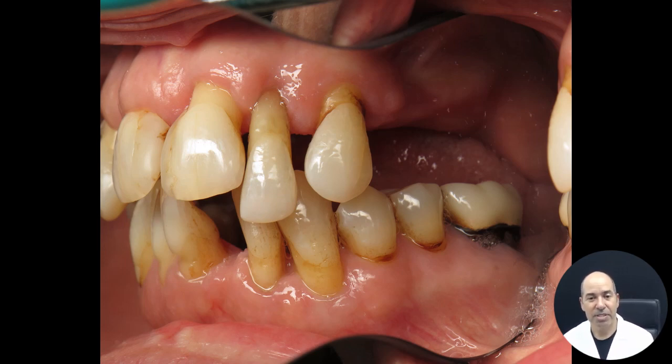And in my office, this is all done digitally. There's one appointment before for some scanning, and we do digital design. I don't have time to go into all of that, but I know you've seen some other blogs on that, where we want to simulate the smile, simulate the bite, take a picture of what she used to look like, how I want her to look, and design that in 3D. Save that file so the day of the surgery, we can convert that new smile design into the new smile.